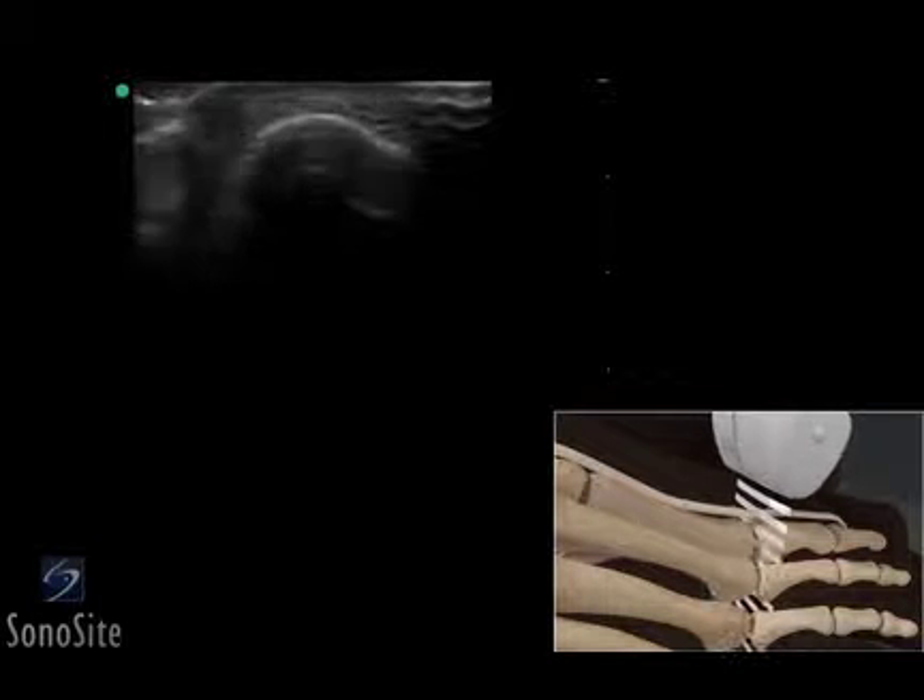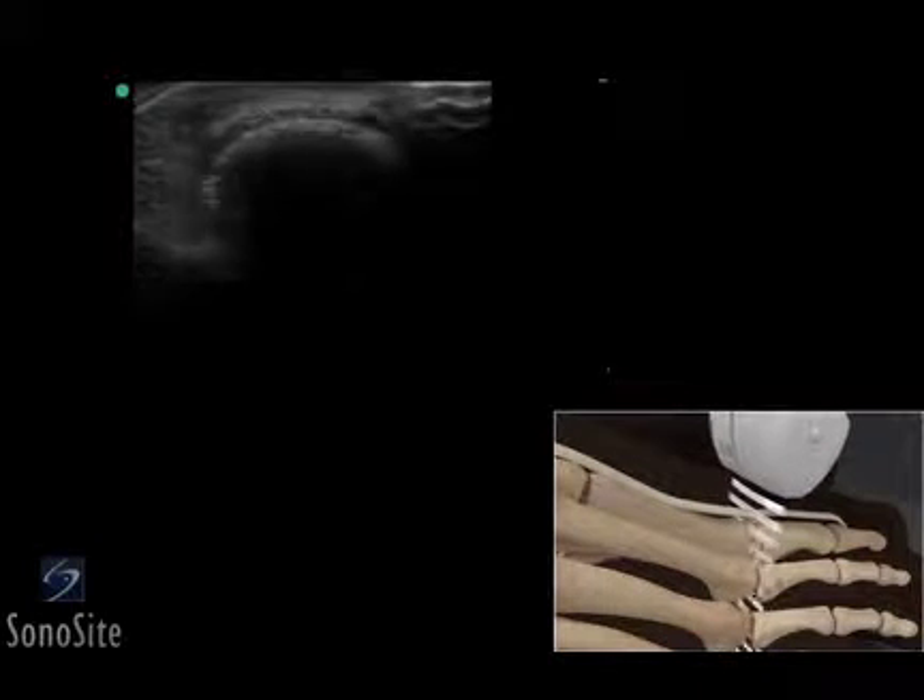The extensor tendon appears as an elliptical structure above the metatarsal head. The transducer should be slowly moved to allow a full view of the metatarsal phalangeal joint.